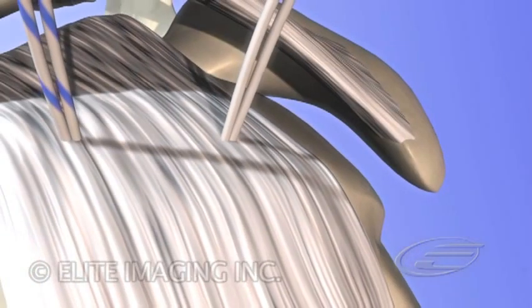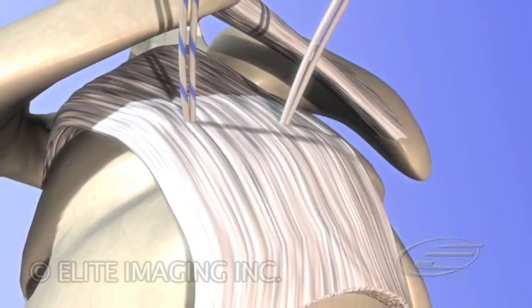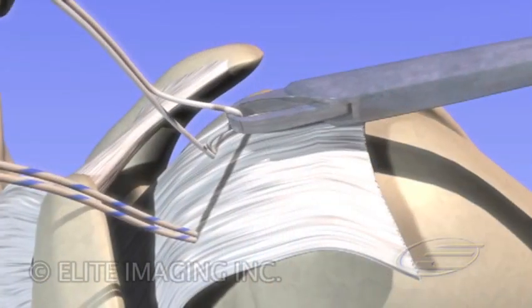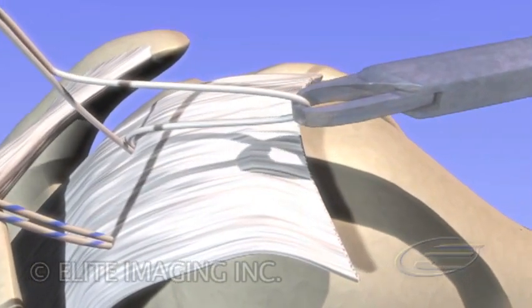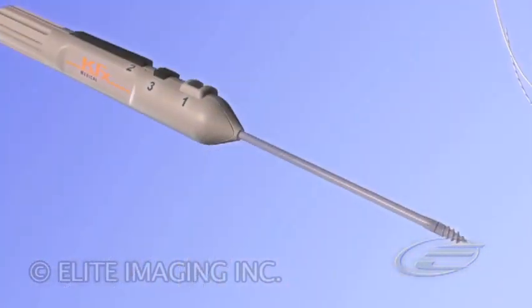A second anchor is placed posteriorly to create the medial row of fixation. Note the ease of suture management. Prior to lateral anchor placement, 1 suture from each medial anchor is positioned laterally on the greater tuberosity.